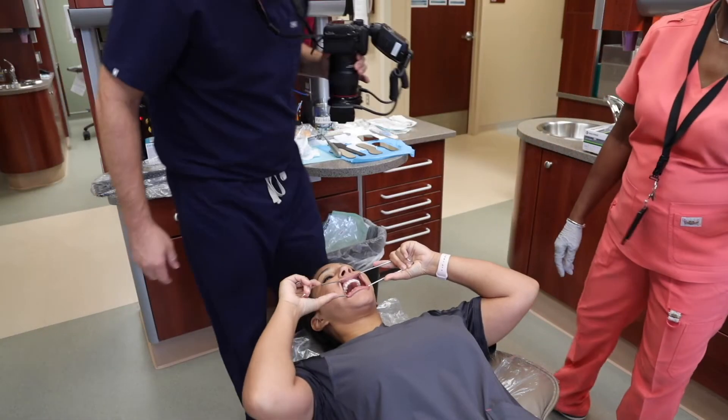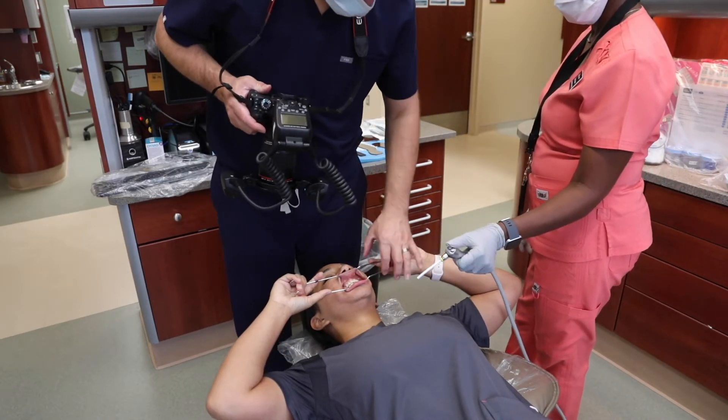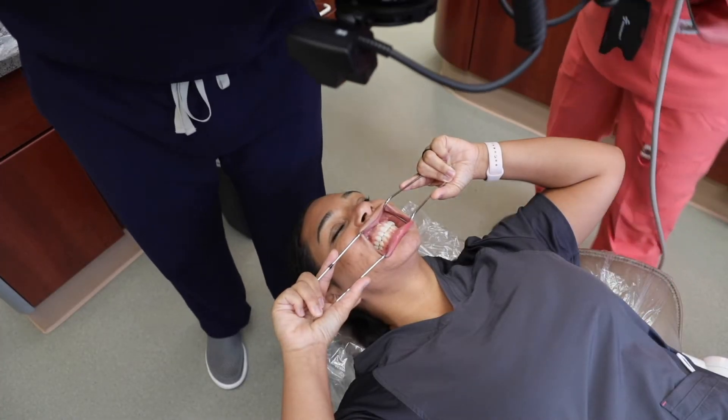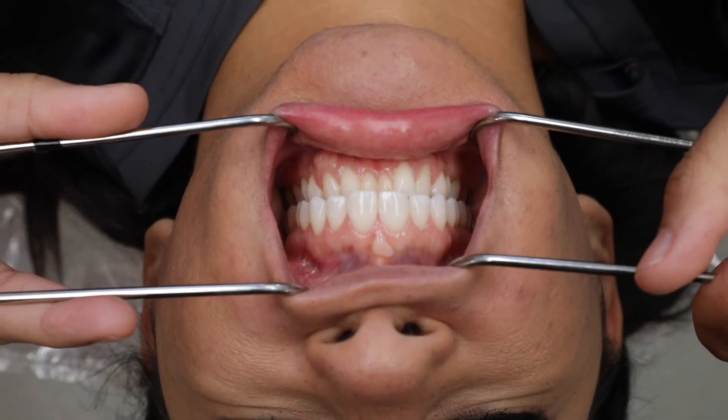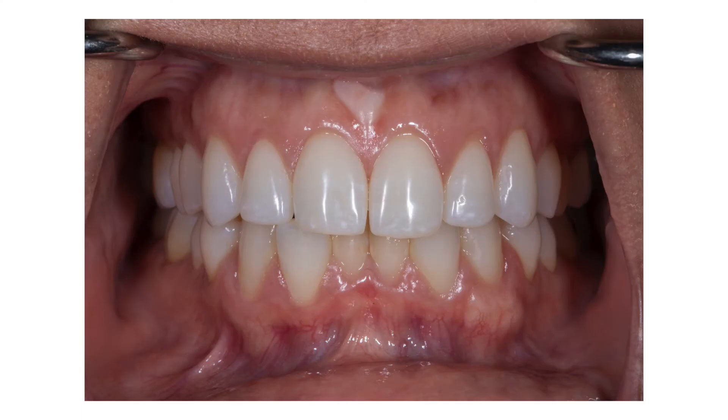For the retracted teeth together image, the patient will bite together in maximum intercuspation and retract using the retractors. Compose the image so that you can see all the teeth from right to left of the frame. The incisal plane should parallel the horizon or upper and lower borders of the image frame. The midline is the center of the image. Focus on the canine so you can get all the teeth in focus.